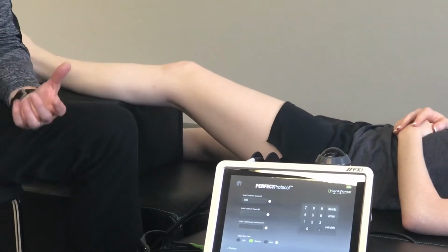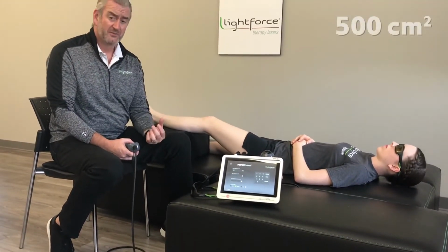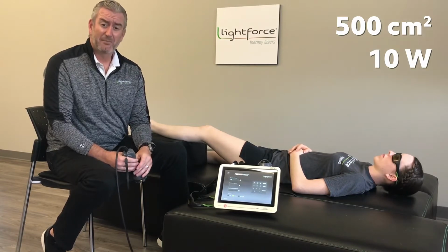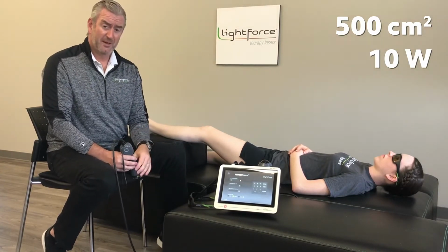Under power, you have some different options. We recommend for acute inflammation that you be a little more conservative on that first treatment. You may be around that 10 watt range if you had a 15 watt unit like this. If you had a 25 watt unit, you probably are going to still be in that 10 to 15 watt range to start. What you're trying to do is avoid any type of increased rebound type pain complaint. And sometimes when you use higher irradiance via higher power, you increase the chance that they might have some rebound pain. So you want to get a feel for how that patient's going to respond after a treatment or two before you start to get more aggressive with your power settings and dosing for that matter.